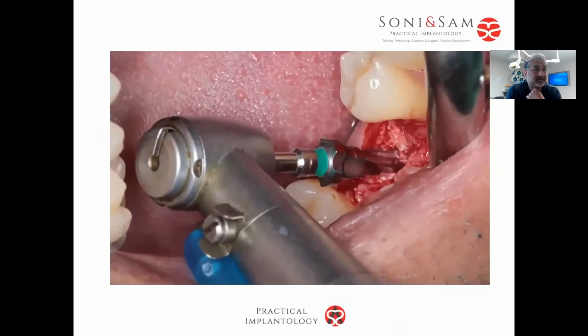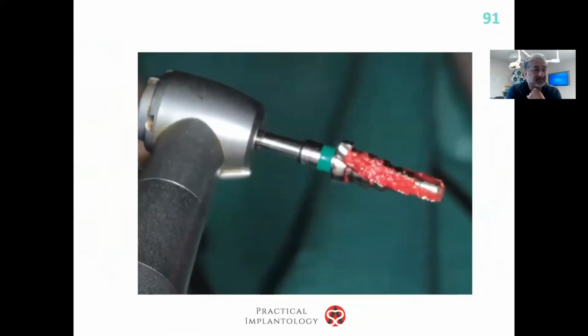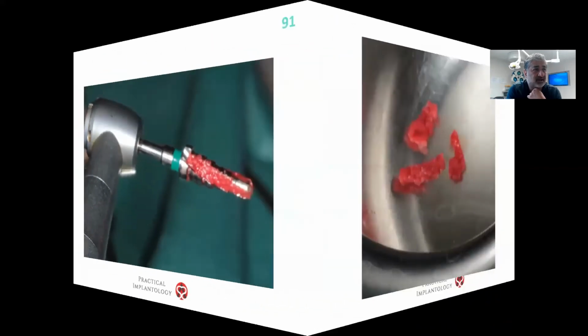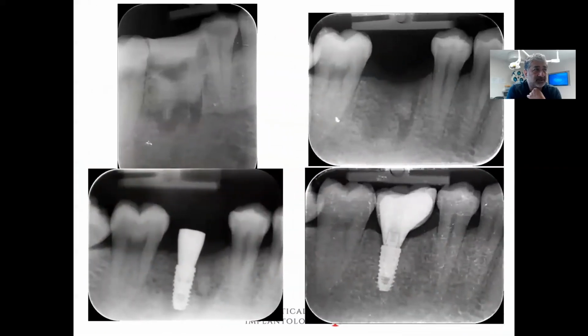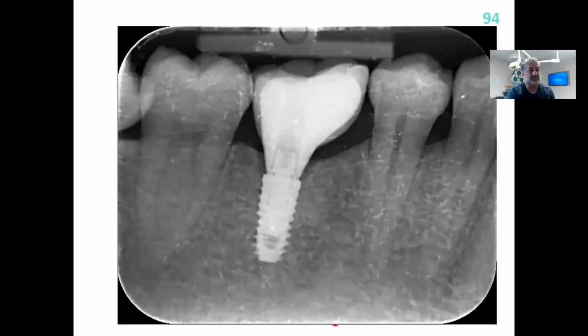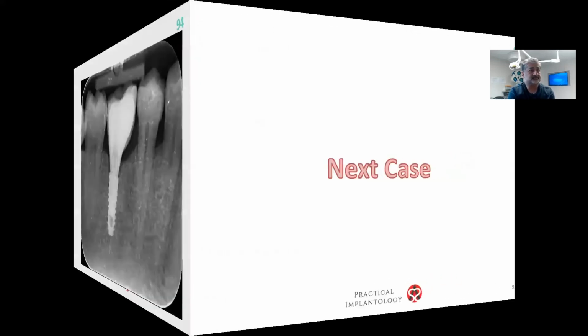This is me placing an implant about 6 months later. And we can see nice bone. This is living bone, and we can also see my implant being placed. You can see this is turned over at 6 months, and this is 2 years, and it's completely turned over into bone. This is the kind of bone I like up against my implant. Bone that will turn over. We get fantastic results with synthetics or autogenous bone, and that is beautiful. Next case.